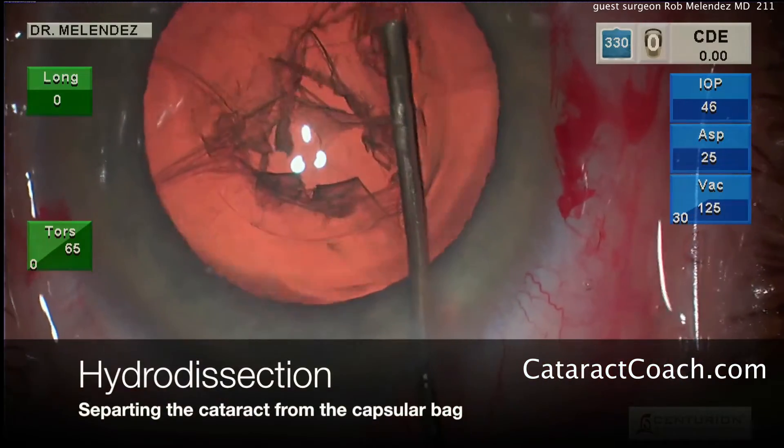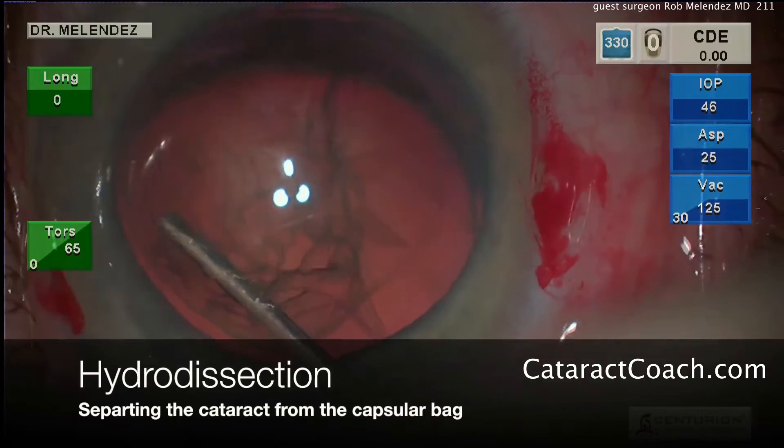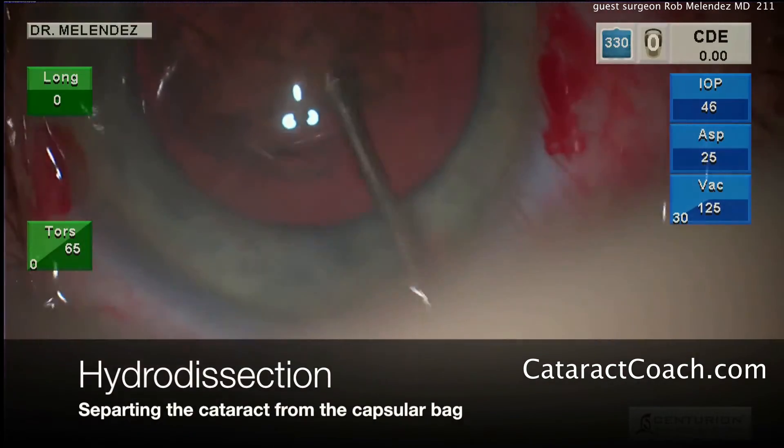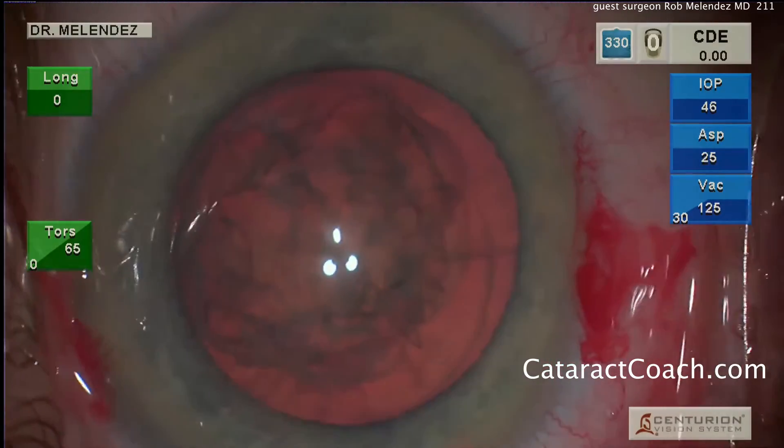Hydrodissection is being performed here with balanced salt solution. You can see a nicely mobile lens nucleus — it's going to make things easy. A little rotation there to ensure that it's completely dissected.